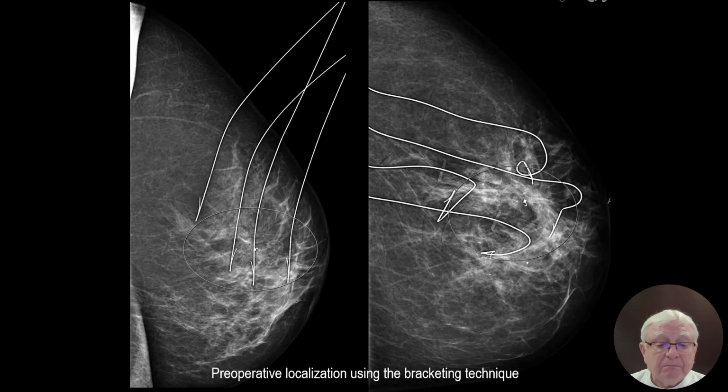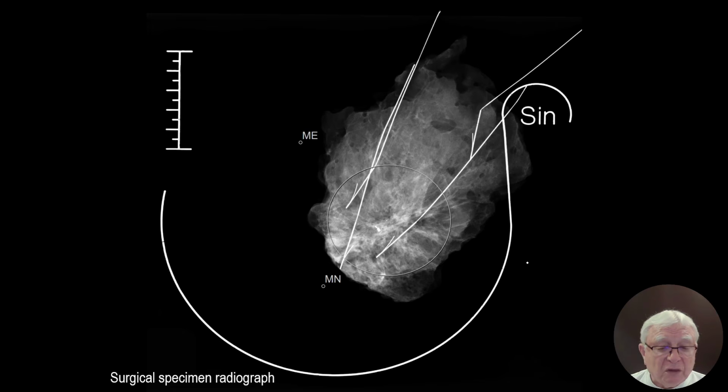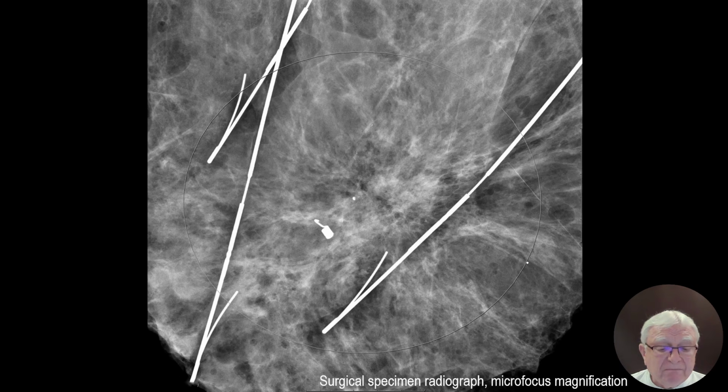We knew that. Do you think that this is going to provide enough tissue? Did we cut through? Give me magnification. Well, we shall see. This one, the histopathologists don't like. Can you imagine when the microtome is slicing and it hits a piece of metal? Fish this out before you put the tissue into the microtome.